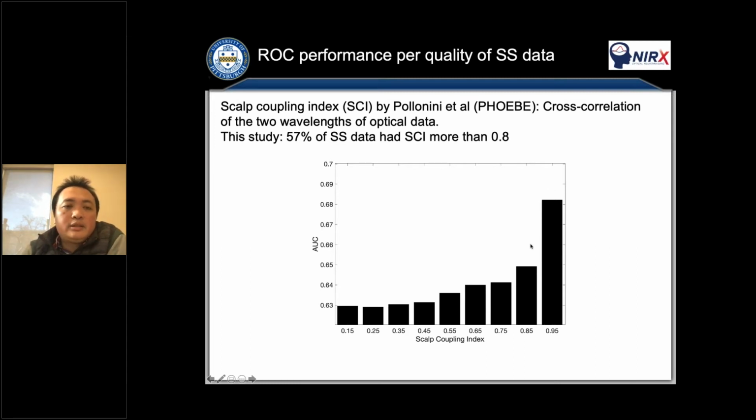The idea is they introduced that you can use two different wavelengths of data. If the correlation between the two wavelengths is more than 0.8, it means the data is good. So 0.8 is the threshold from them. If less than 0.8, maybe you can remove that one, or this is just to quantify or to judge whether the data is good or not.